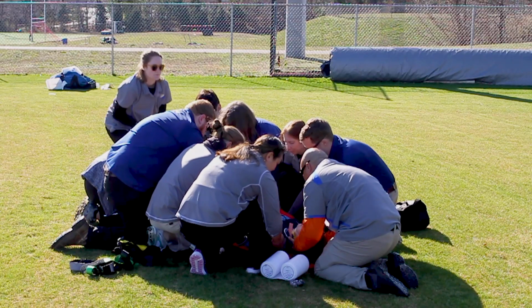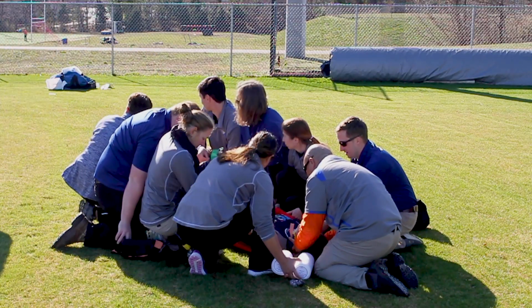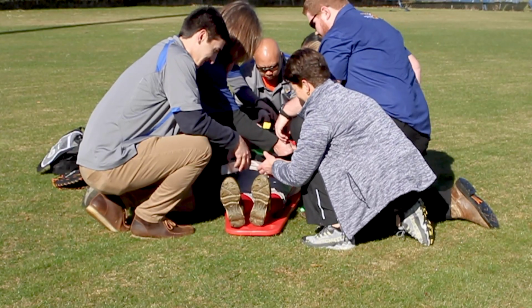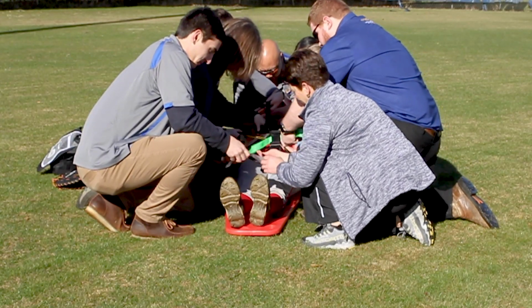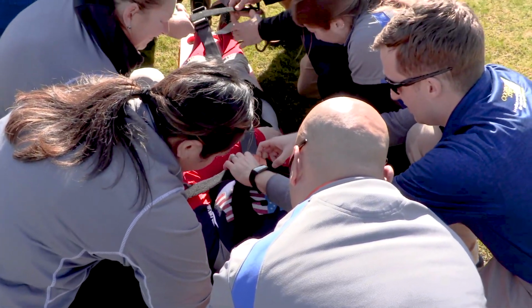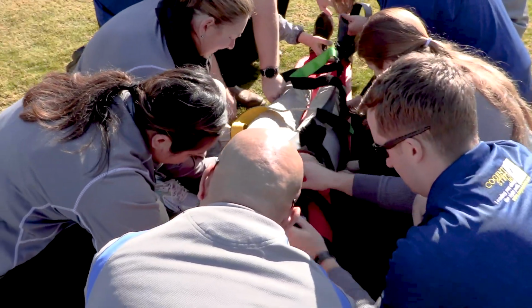The body straps are placed. Hips are the first landmark, followed by the rest of the body. It is important that the lead maintain good stabilization of the head while the body is being secured. Remember, secure the body first, then the head.